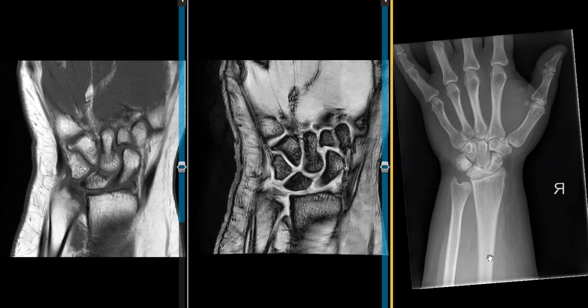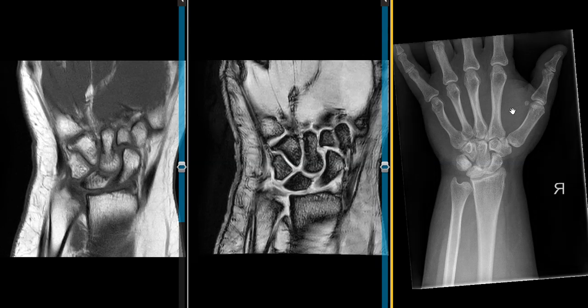Hello, this is Dr. Gay from First Lake MRI. This is a 31-year-old female who fell about two months ago and has had wrist pain ever since. She got X-rays and they look normal. The only thing of note is that the ulna is a little bit shorter than it should be. This is the radius, and normally the ulna is just a little bit shorter, and there's a little horizontal piece of cartilage — fibrocartilage — that goes across.